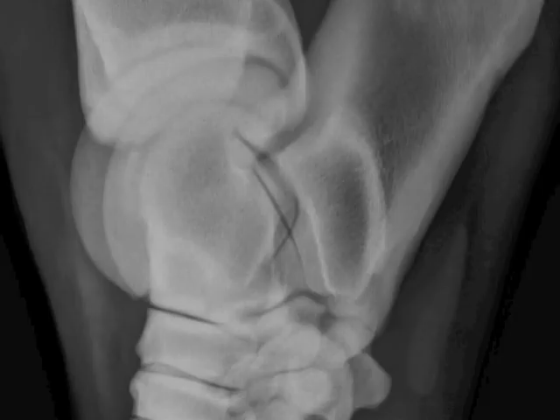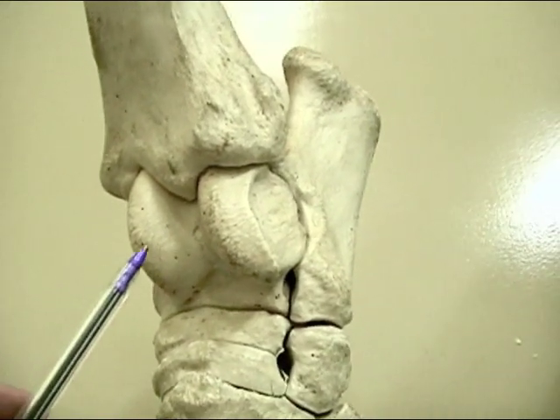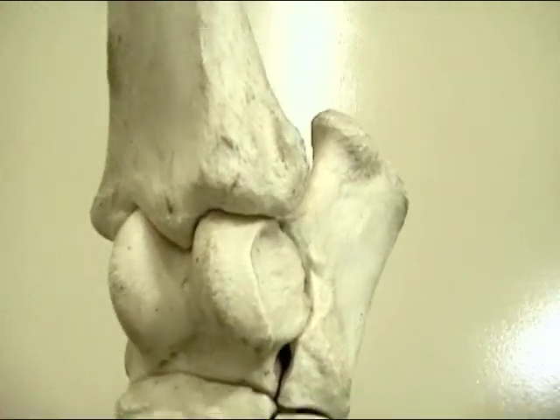This is a picture of a horse's hock with a swelling here and also a swelling here, which we call a bog spavin, and it's due to a thing called OCD. There's a little fragment of bone just floating in space just there, which we treat with arthroscopic surgery. This is the bones - the fragment's going to be coming off the bottom of the tibia, just there, and we're going to be entering it over the top of this ridge, which is called the trochlear ridge.